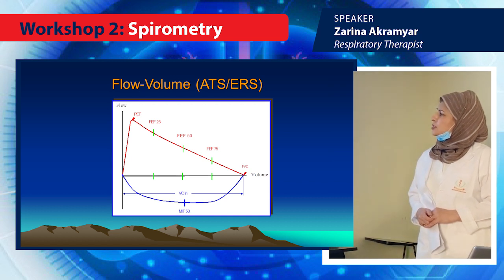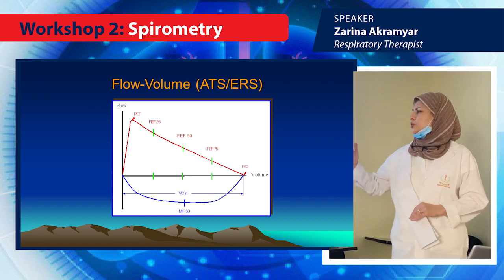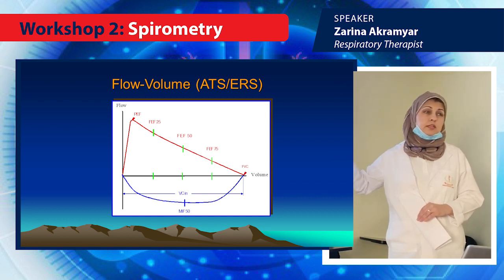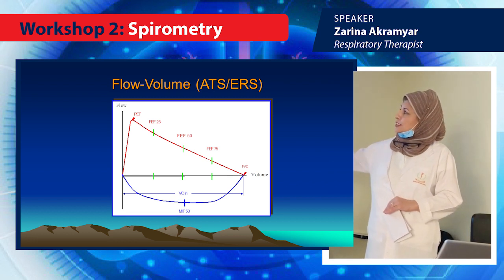Okay, so the blue part is not that important because it's inhalation. Sometimes it gives us a lot of information if there is a fixed obstruction. I will show you that when I have a slide for it. But the red part is the exhalation.